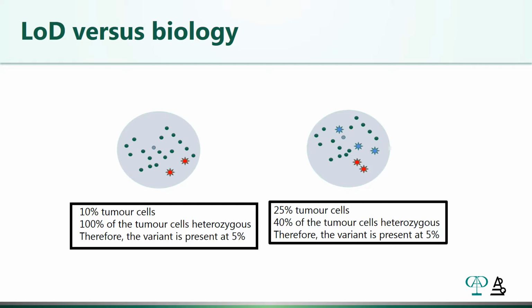And I think it's important to recognize that the biological parameters have an impact on the interpretation, even when all technical parameters appear to be met.